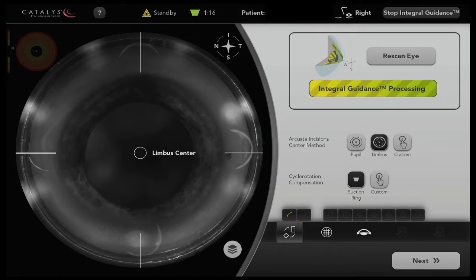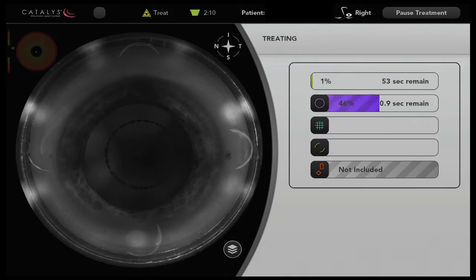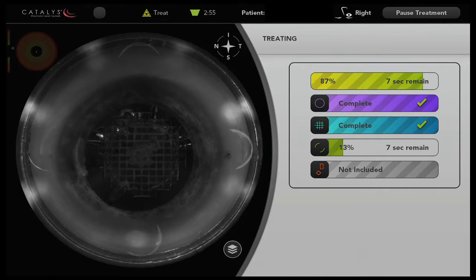Now in this second case, we have just a minor amount of manual reorientation of one degree, but it's very reassuring that this can be accomplished with a great degree of specificity and certainty.